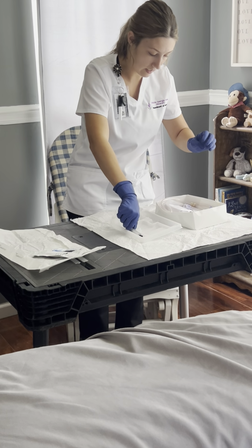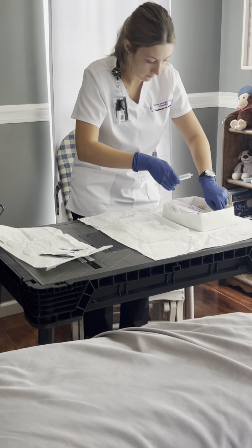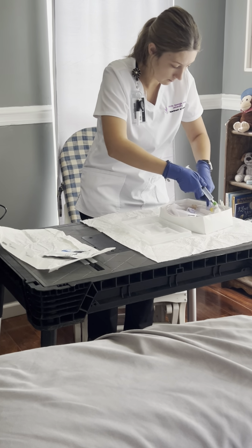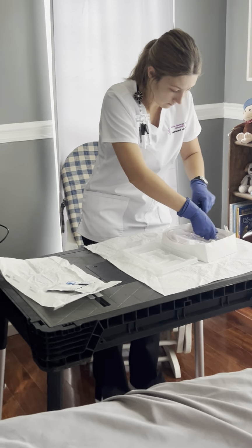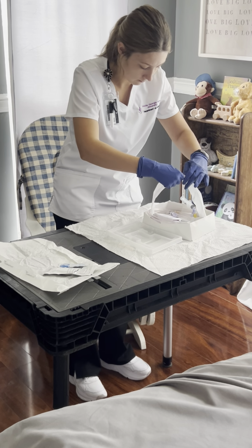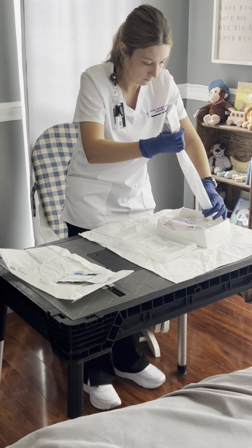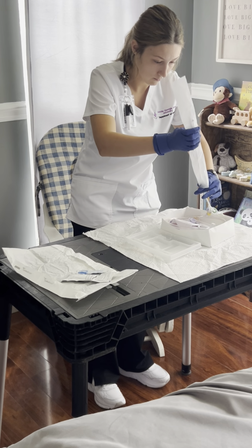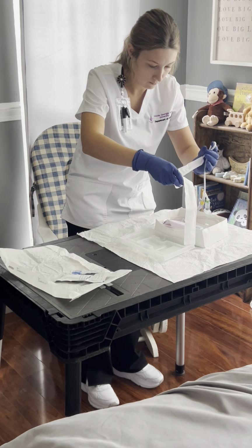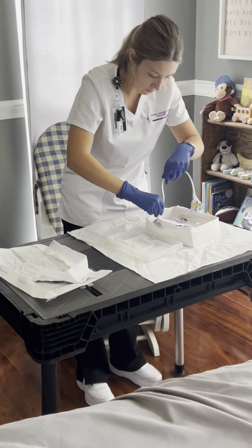And I'm going to attach my saline. Going to dip it into the lubricant.